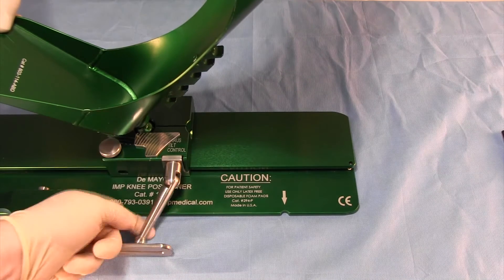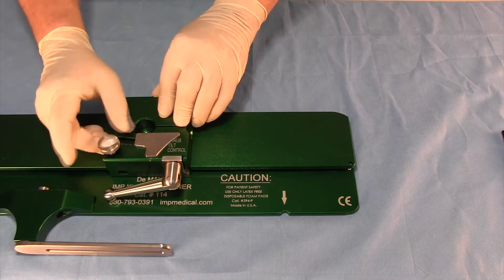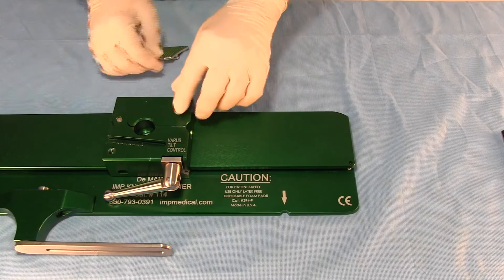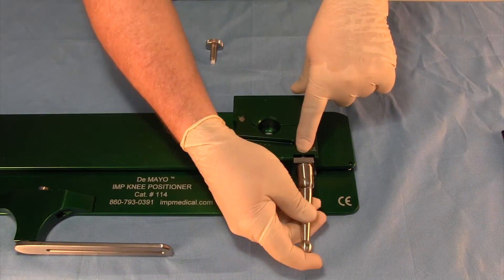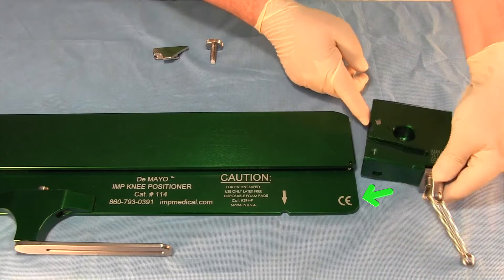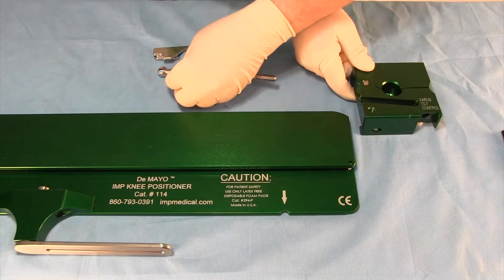To remove the carriage, unlock and remove the boot. Unscrew and remove the locking brake and slide off the Varus Tilt Slide Lock. Unscrew the handle. Slide the carriage towards the end of the knee positioner labeled with the European CE mark, then remove the handle completely. There are no additional parts that are designed or required to be removed for cleaning.